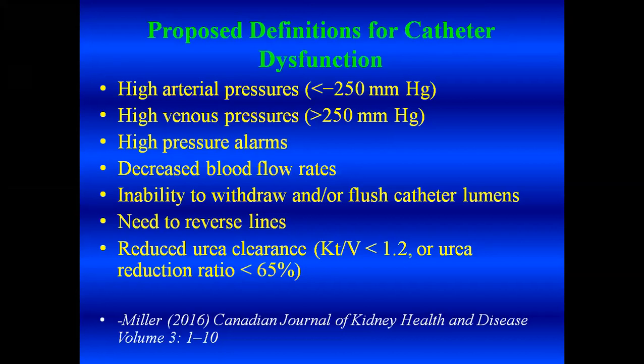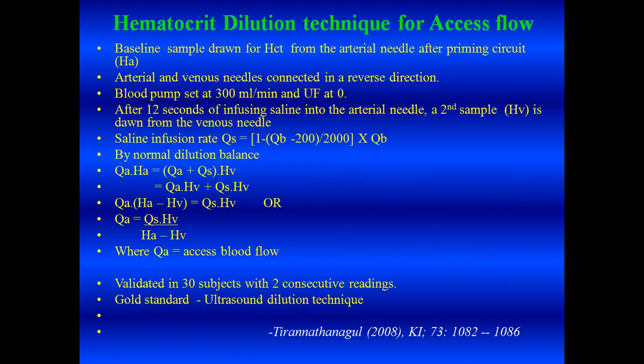A ball valve mechanism operates with a fibrin sheath in the catheter, wherein it's easy to flush saline into the lumen and it moves freely, but when you attempt to aspirate from a lumen, nothing comes, because the fibrin sheath is sucked against the holes of the catheter. So that ball valve mechanism would generally indicate a fibrin sheath in the vein over the catheter.